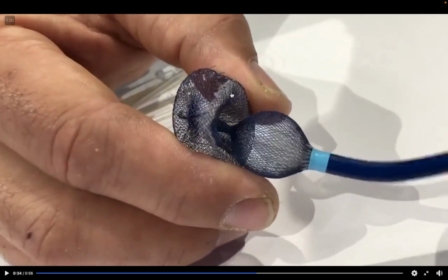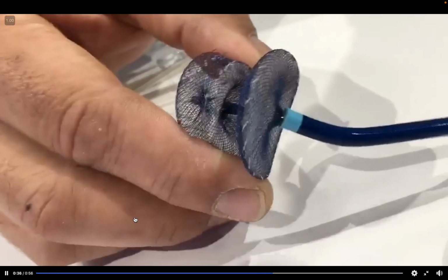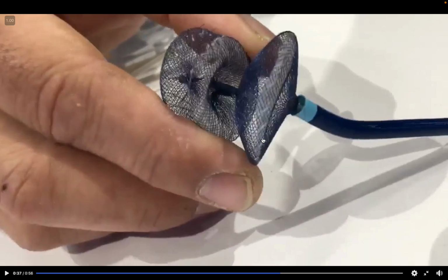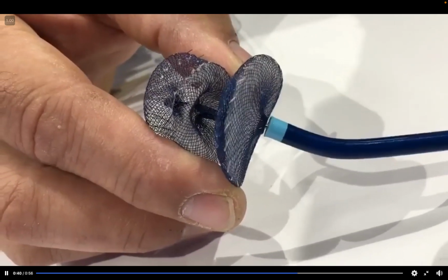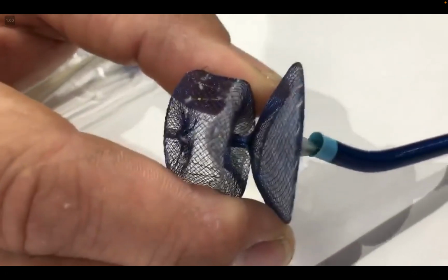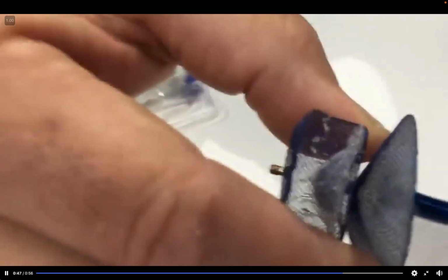So you can see that this goes inside the patient, and then there's a smaller disc. The apparatus contracts, if you will, and then the outer sheath will blow up like a ring. And this area is here to catch the ridge. So this sits outside of the left atrial ostia. Basically it's to seal the appendage versus plugging the appendage, and this helps anchor the back end a little bit.